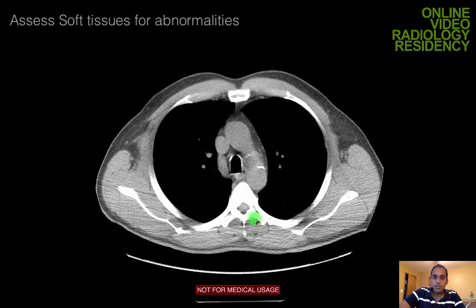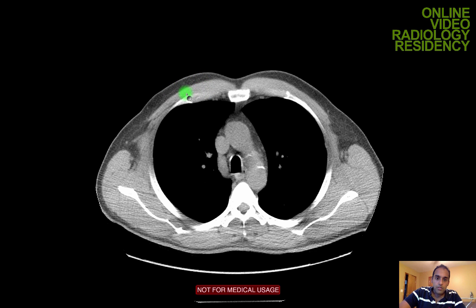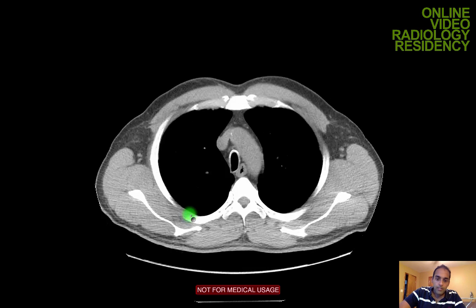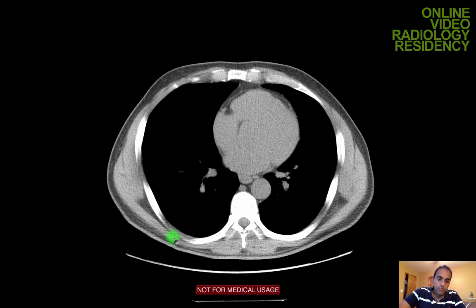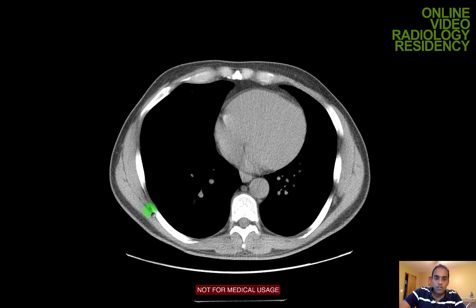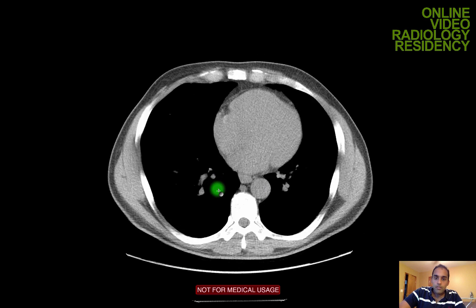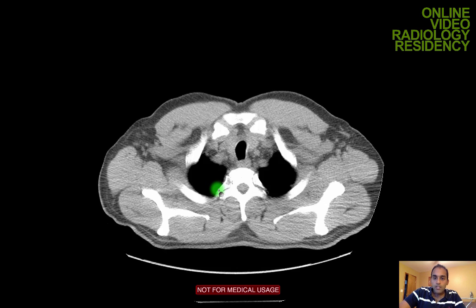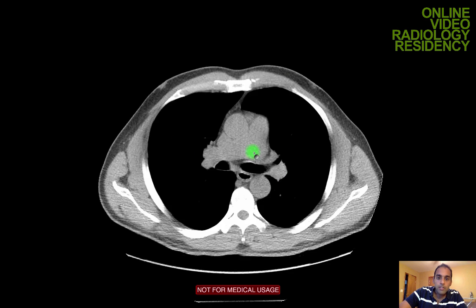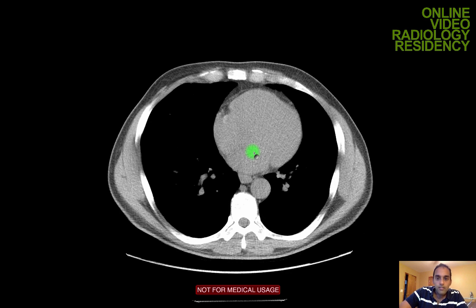Now for soft tissues: you can see subcutaneous fat and muscle tissue including the pectoralis muscle, muscles of the rotator cuff surrounding the scapula, the latissimus, and the deep back muscles. I look for any obvious soft tissue lesions. Sometimes you can make specific diagnoses — for example, absence of the pectoralis muscle can diagnose Poland syndrome. In a female patient, I would look at the breast tissue for any masses or focal lesions.